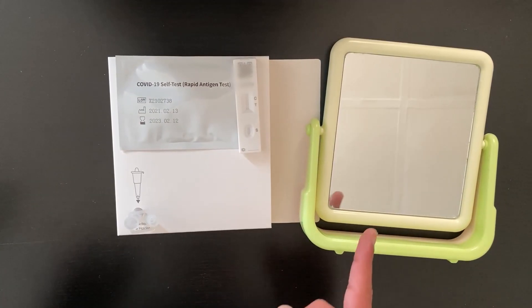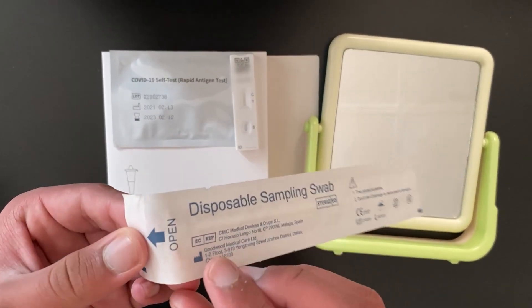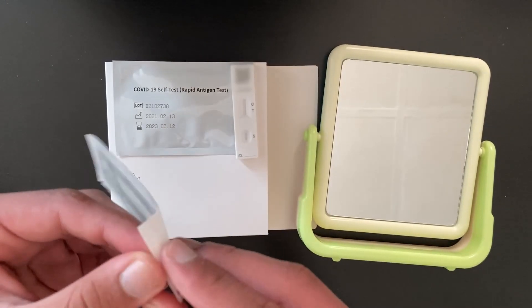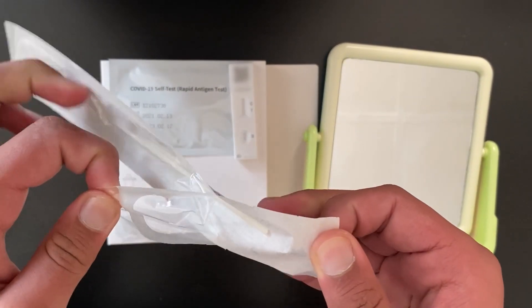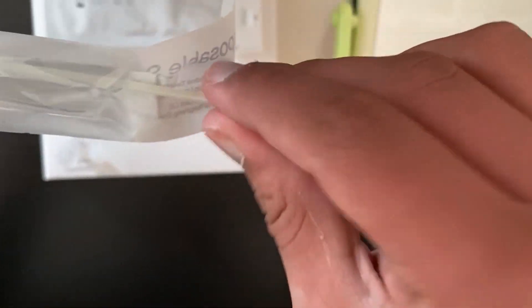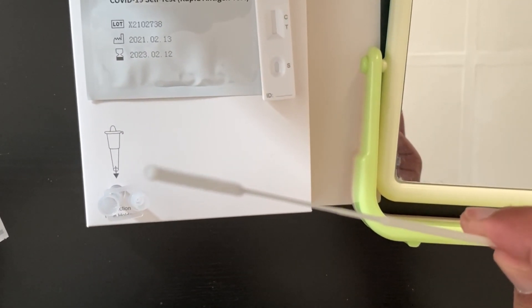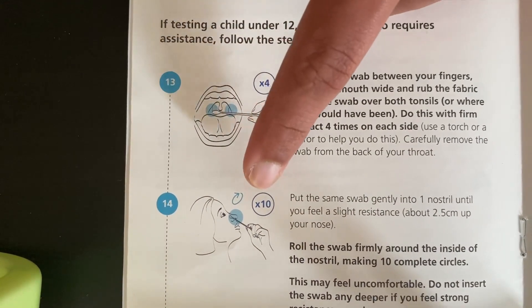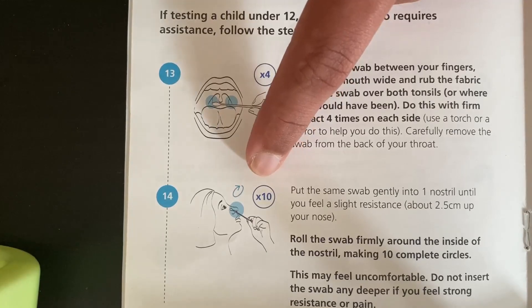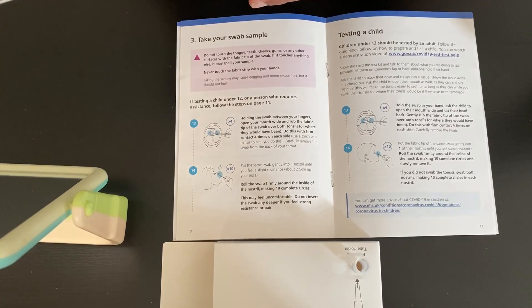Now you need to get your mirror and your sealed swab. Open it using this little tab here. Ensure that you hold the swab from the plastic end of the stick only — the fabric end shouldn't touch anything apart from your tonsils and your nostrils. You need to rub it on your tonsils four times on either side and in each nostril around 10 times. Make sure it doesn't touch any part of your mouth such as the gums or the tongue.